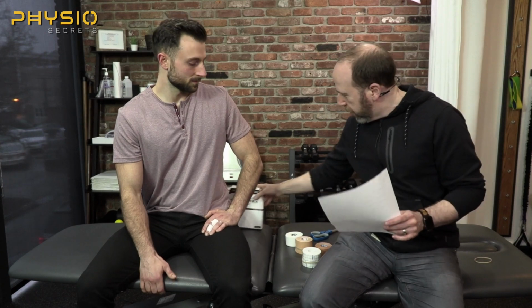So with a neurological change, so let's say we are looking to reduce pain, we don't necessarily need to grab like Leuko tape or anything too rigid, because if I do that, it's going to be pulling on the skin a lot. Just a nice flexible K-tape does just fine, because the idea behind pain reduction is that we're actually trying to increase the proprioceptive or mechanoreceptor input through the skin and gate the pain at the dorsal horn. So when you're doing that, it's kind of like rubbing a boo-boo, right? When you put tape over an injured area, it feels better. So with that in mind, K-tape works really well.